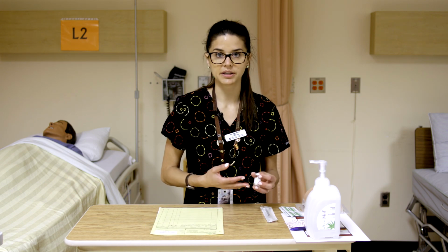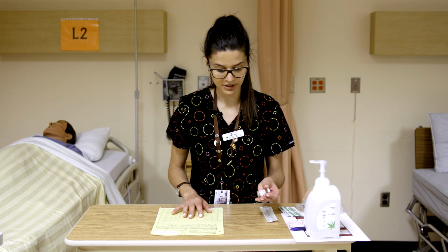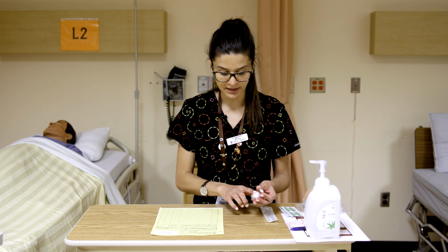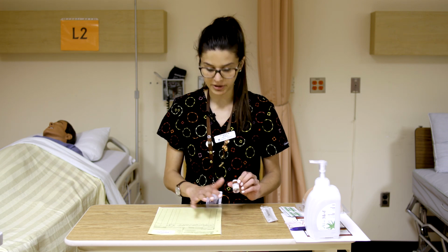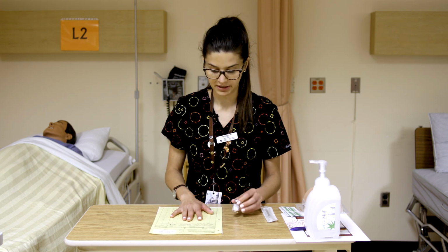Move our container from a drawer or a Pyxis machine or a fridge in some cases, as it's supplied by pharmacy, and you're going to want to make sure that this information matches up with what you're in fact supposed to be giving to your patient.